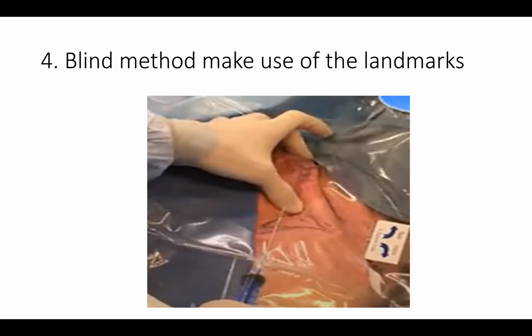In that process, you are going to hit the subclavian vein most of the time. The key thing here to avoid pneumothorax and hemothorax is that the needle should go horizontal. The plane of your advancement should be horizontal. That is how the needle should go. The needle should not go oblique while going deep down. No, horizontal. That is the key thing. If you try it once and you don't get it, a little bit horizontal, just manipulate it around. You will get it there very fast.